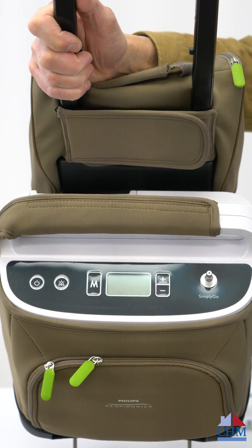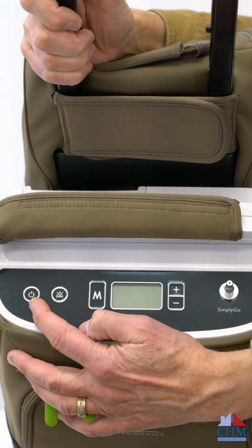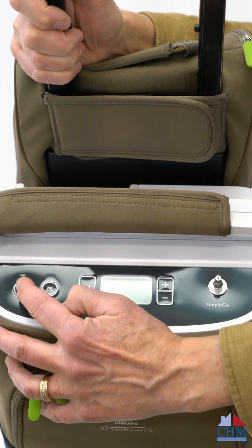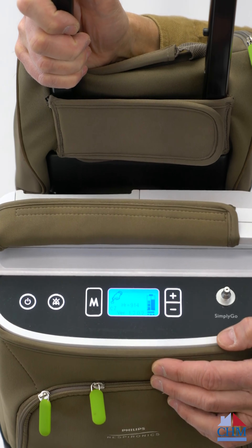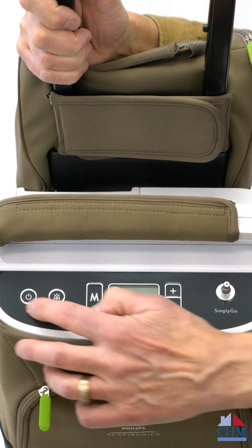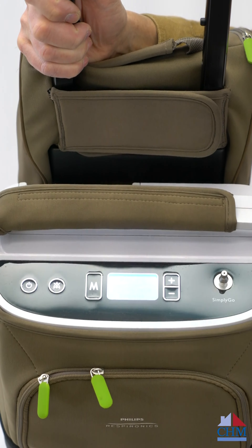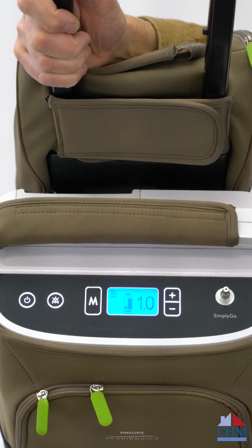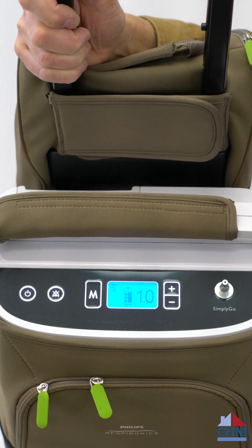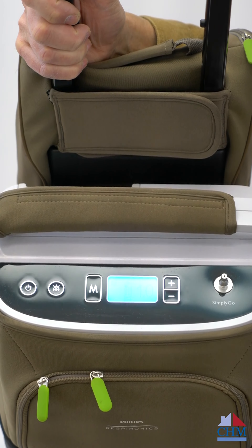Looking at the front of the unit, there's a power button that you press. I'll press it once, then press it again — you'll notice when you press it, the screen shows a finger pushing down again. Hit it once, hit it twice, and it will start. When it comes on, you can see in the center that the battery is charging because I've got it plugged in.